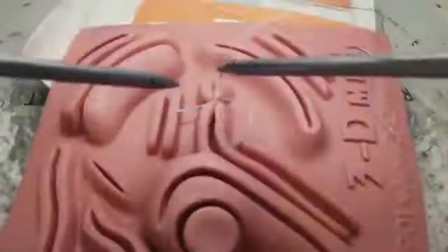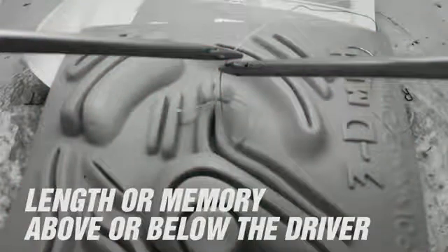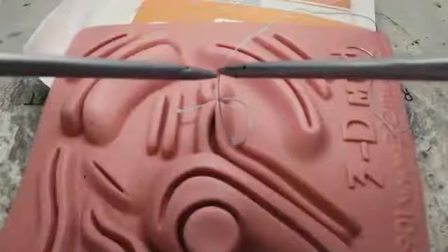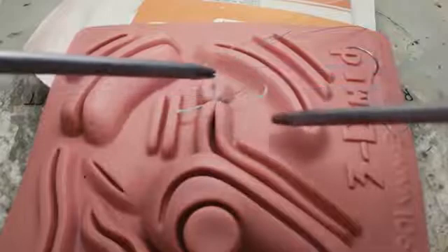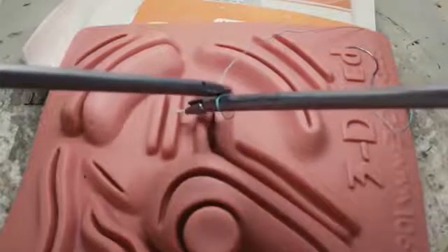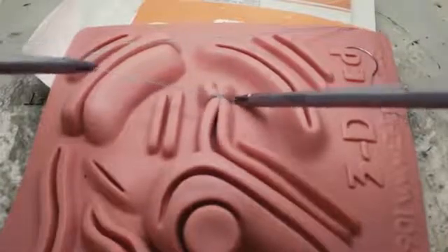Each time you re-grasp the suture to change hands, make a conscious decision to either grasp on the knot side of the driver to shorten your loop, or on the needle side of the driver to lengthen it. A short loop facilitates snugging down the knot in one motion rather than multiple. Square knots require that you snug your knot down in the tissue plane parallel to the axis of the knot.